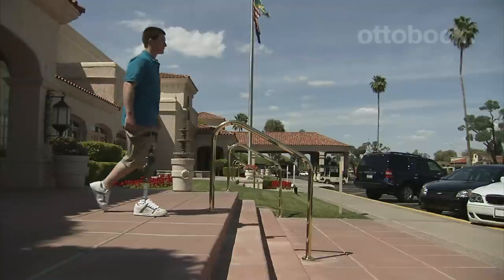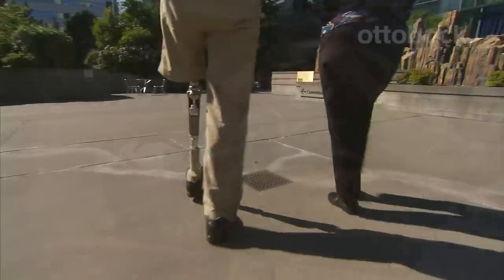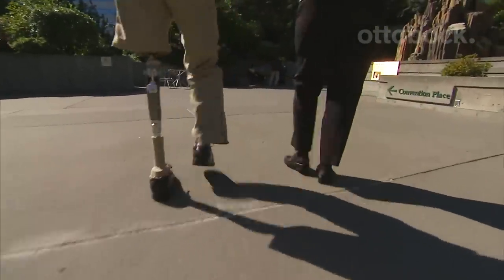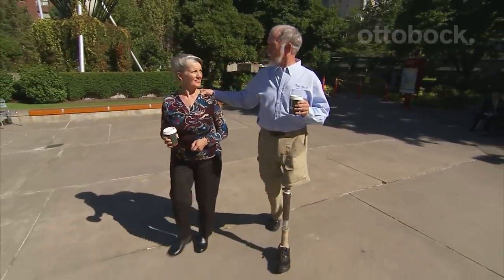Together, the C-Leg and Helix hip represent the most advanced, most secure prosthetic for individuals with hip disarticulation or a hemipelvectomy. For our first anniversary of the surgery, Bob walked a mile — that was his anniversary celebration — and he'll be 75 in November. The next thing to do is play a few holes of golf on his 75th birthday.